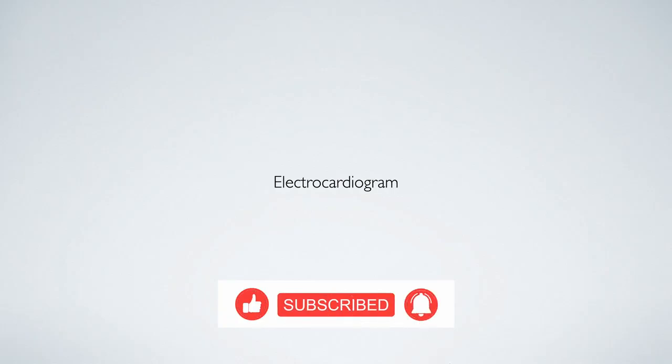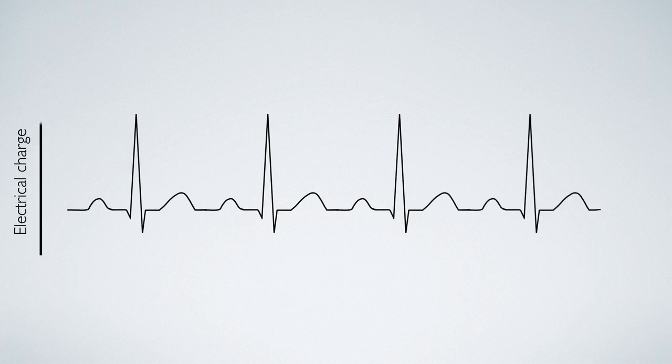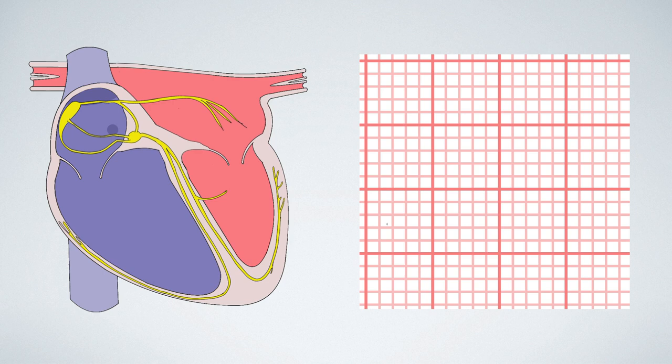Learn Medicine Show. In this episode, we are learning about the electrocardiogram. An electrocardiogram is a visual representation of the heart's electrical activity over time. The electrocardiogram records the heart's electrical activity using surface electrodes.